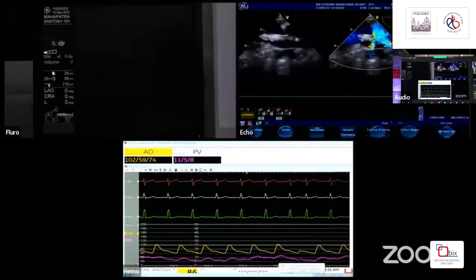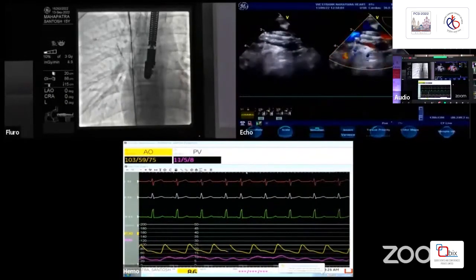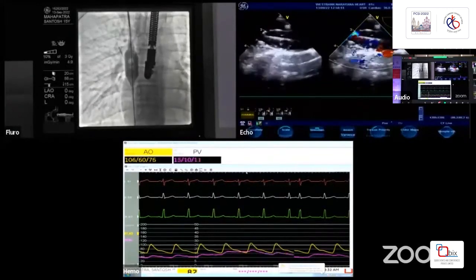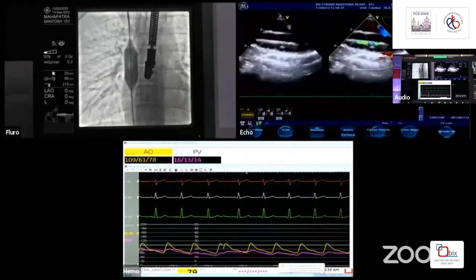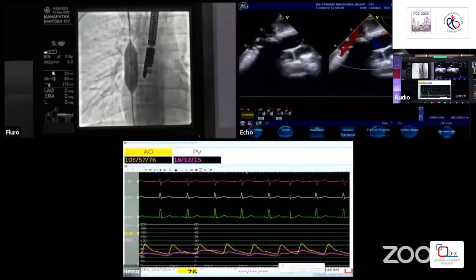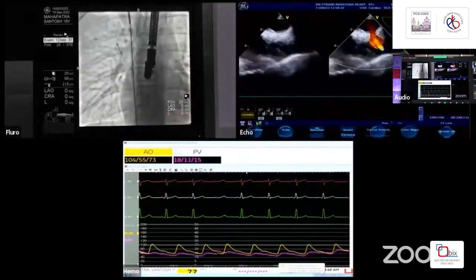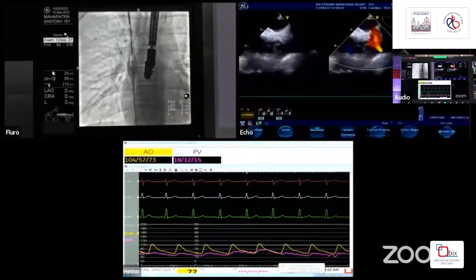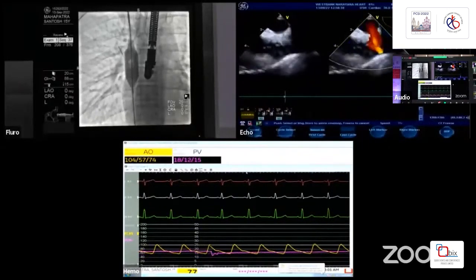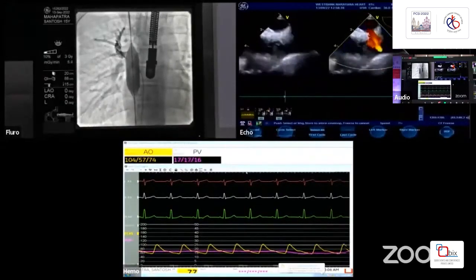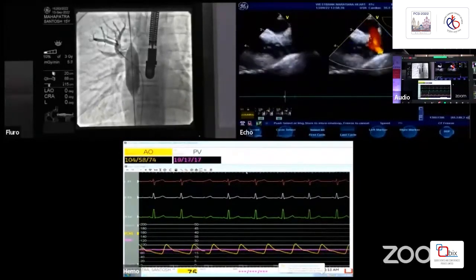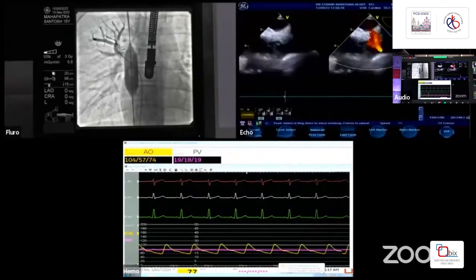We are downsizing the balloon — inflating a smaller Z-Med balloon, 20 mm by 40 mm. Even with the smaller balloon fully inflated, pulmonary venous pressure has again risen to 15 to 16 mmHg. On transesophageal echo, the right upper pulmonary vein is still obstructed — the obstruction is slightly less than with the larger balloon, but still significant. Injecting contrast again shows hanging of dye; the dye is coming partly into the LA but the venous pathway remains obstructed.